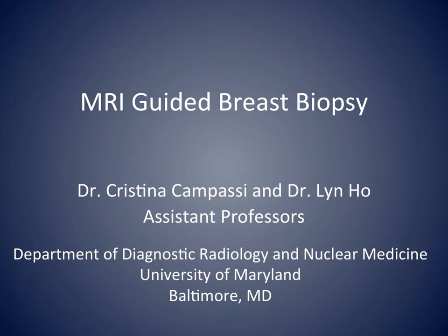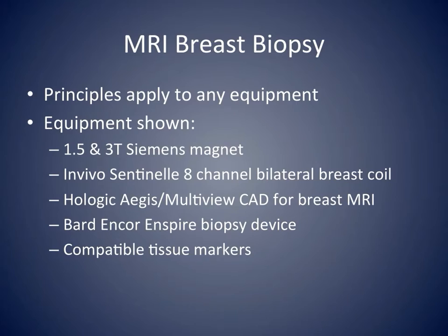Dr. Ho and I put together this educational video for physicians and healthcare professionals on MR-guided breast biopsy. The general principles about MR-guided breast biopsy illustrated in this video apply to any equipment commercially available. The equipment shown in the video is what we use at our academic institution and is listed here.